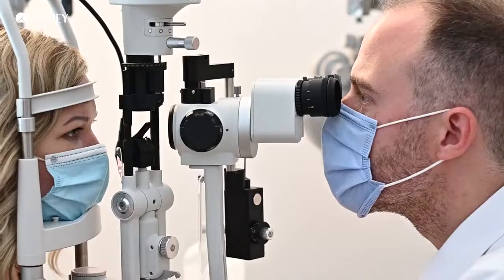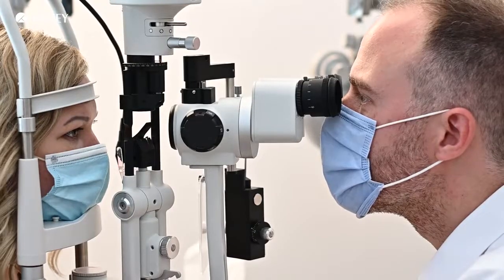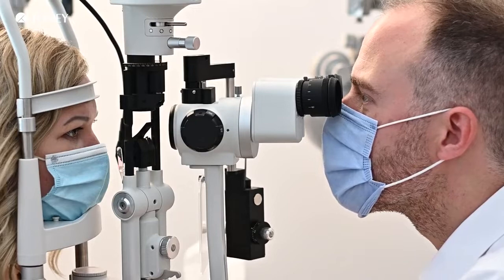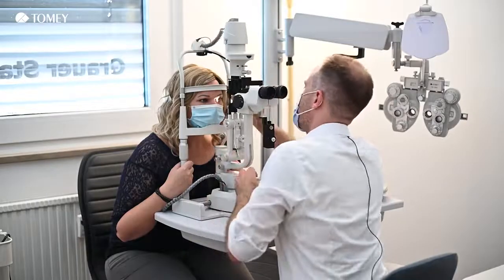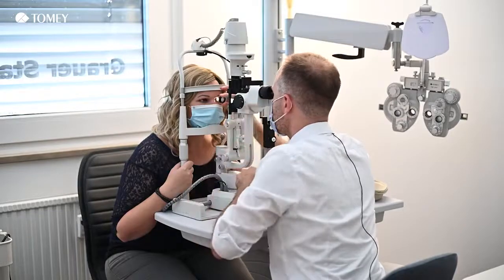Yes, thank you for that very important question. The first thing you have to think about is don't make your diagnosis with only one measurement. Repeat your measurements and don't rely just on one piece of information. All the devices have one problem: they only measure the parameter you need with their special technique.